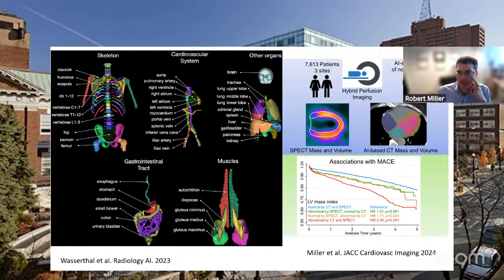So it started by being trained off a small subset of CT scans where somebody went in and manually segmented all of these structures top to bottom. So it probably took hours and hours and hours to segment all these things. Then what they did is they trained an early version of the model and had the model pre-segment the next set of CT scans that were refined. And then they iterated this process until they had a model that worked pretty well.